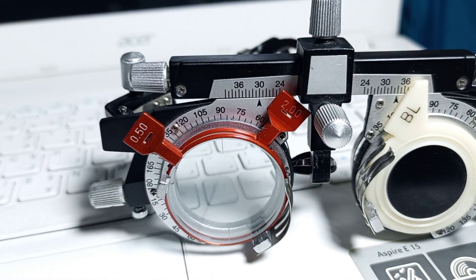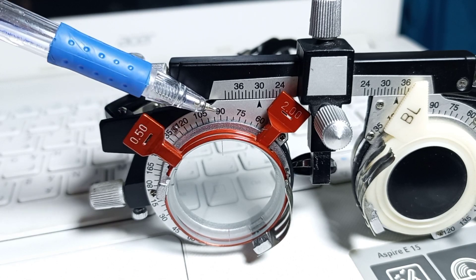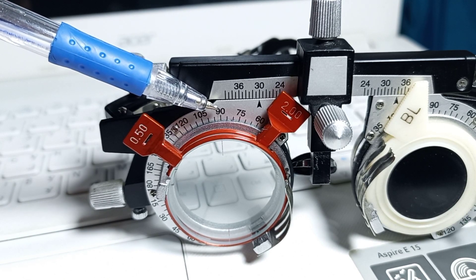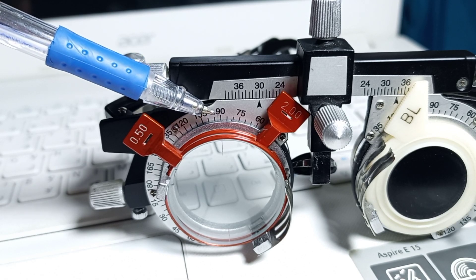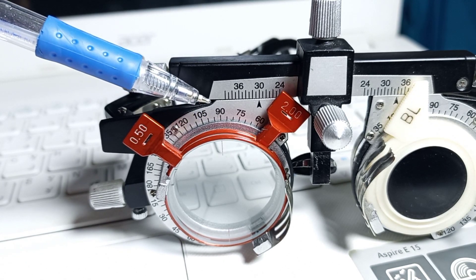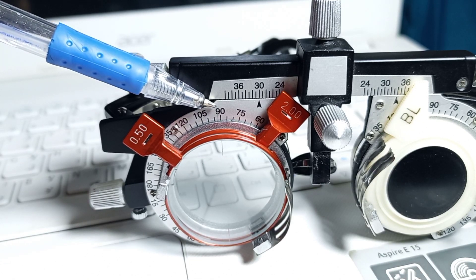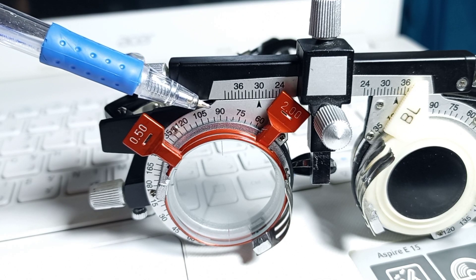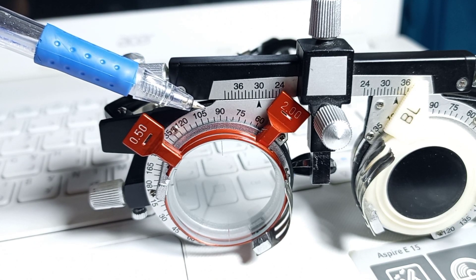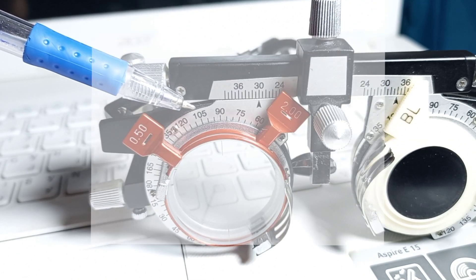To summarize: in bracketing, our rough axis was 90 degrees. In axis refinement, we moved from 90 to 95 (step 1), 95 to 100 (step 2), and 100 was our refined axis. Keep in mind that in axis refinement you can only move a maximum of four steps: 90→95, 95→100, 100→105, and 105→110. You cannot go beyond this.